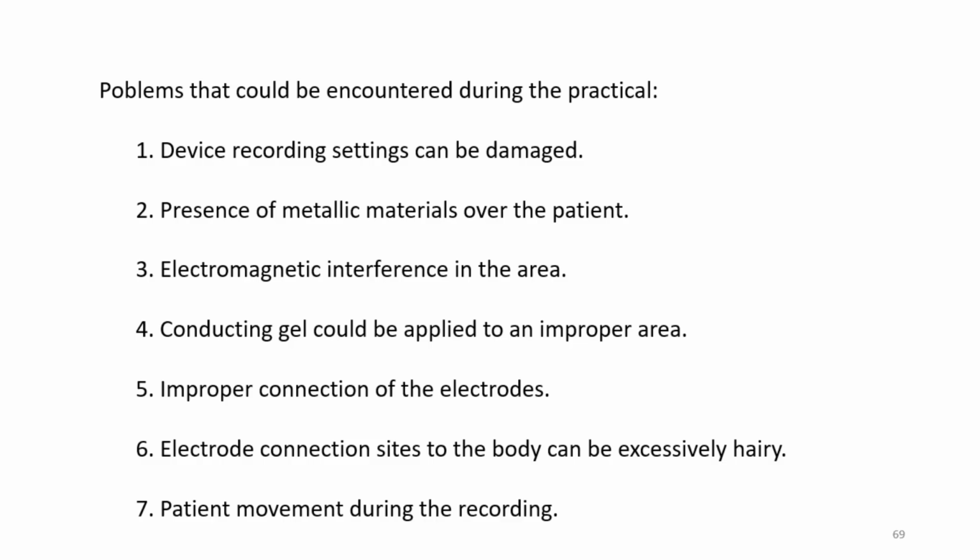Here you see the problems when you are recording electrocardiography. Device recording settings can be damaged. You should set normal values; amplitude and speed should be set. Metallic materials should be removed from the patient, as they can cause artifacts. Electromagnetic interference in the area can affect the recording. You should stop instruments, or go somewhere else.